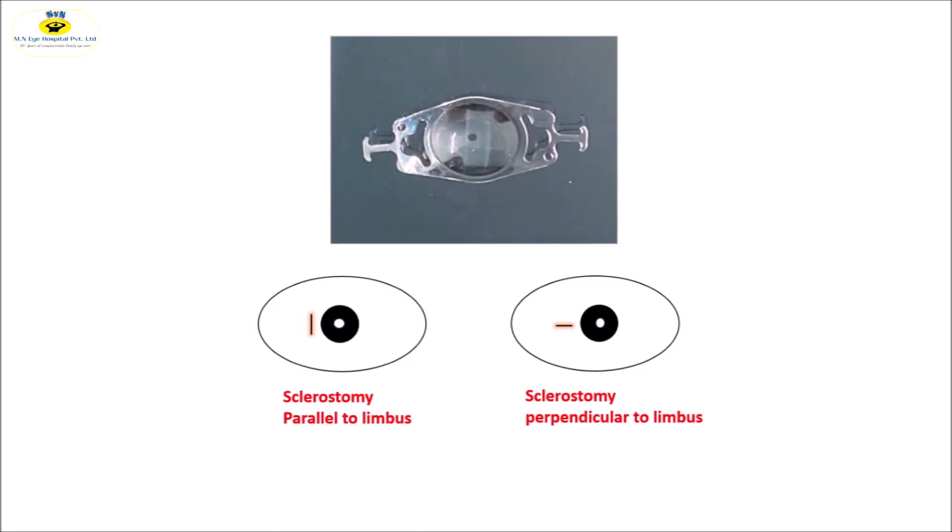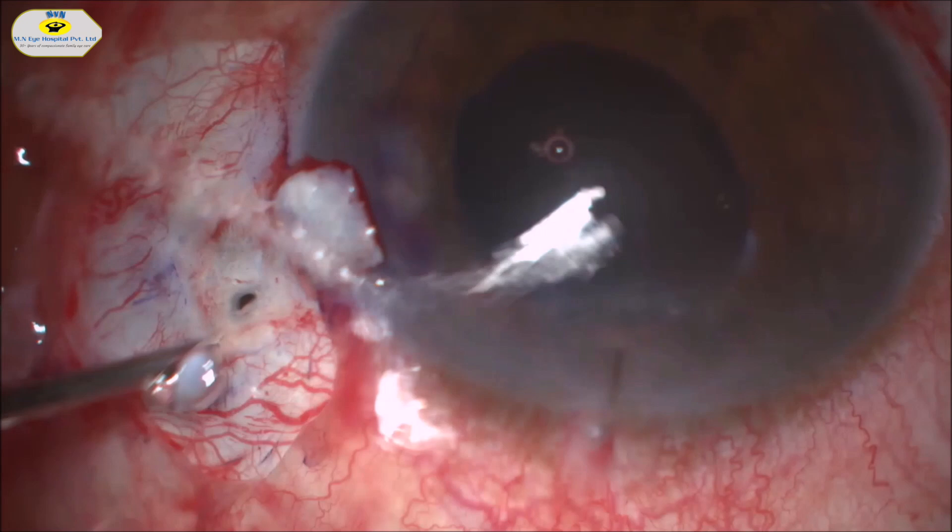This is trick number 1: when the sclerostomy site is parallel to the limbus there is an increased risk of slippage of the haptic, but when it is placed perpendicular to the limbus there is less chance of slippage.